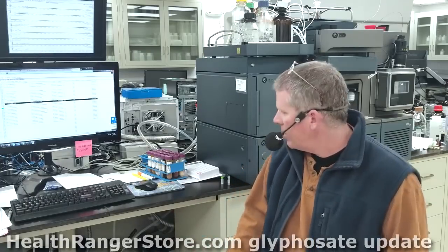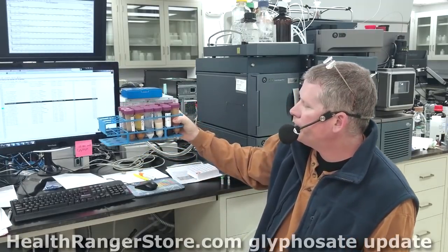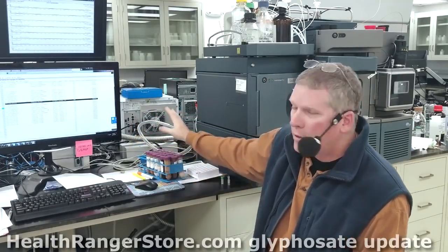And we have 700 different products in our online store. We are going to be testing every one of them. We're not there yet. It's going to take time. I mean, like here's a batch of what we're testing right now today. Every one of these is labeled, different product ID, lot number, how many grams of product, how many milliliters of methanol that we're using as the extraction process.